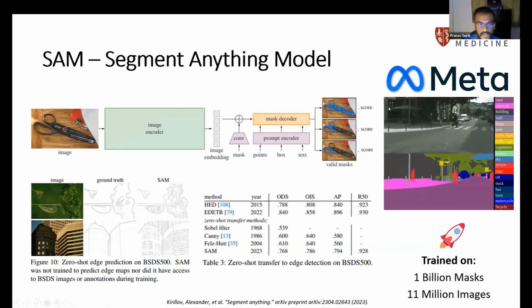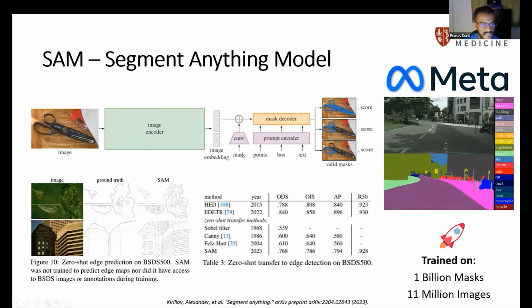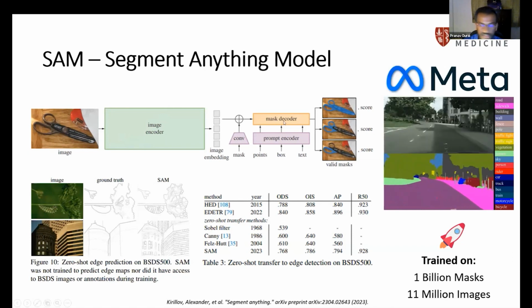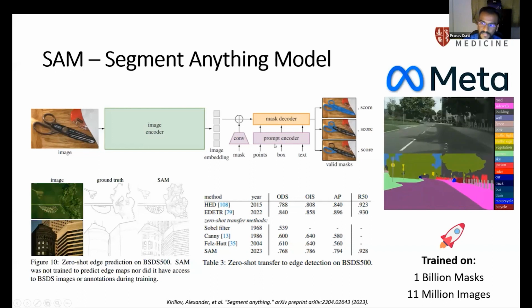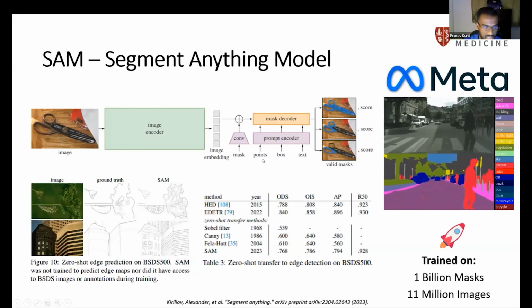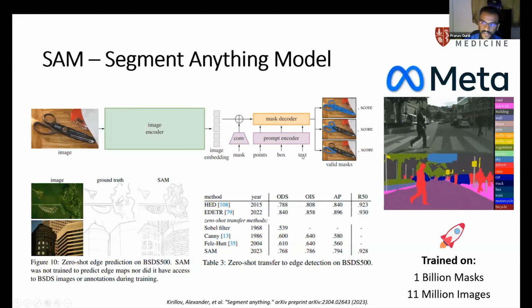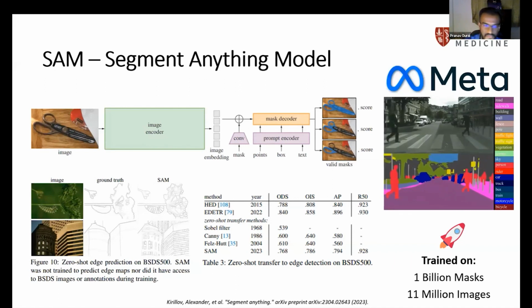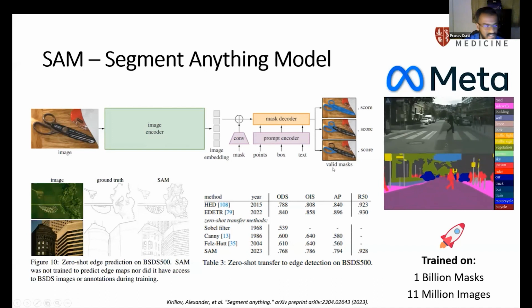this model. You also give it a mask, right? The ground truth mask, that is passed into the convolutional layer. And you also have a mask decoder, right? And you can pass in a few parameters as prompts, right? So it can be points in the image where the specific mask is present, or it can be a bounding box, or it can also be a textual prompt where you can say that, hey, there is this structure in this particular region of the image.